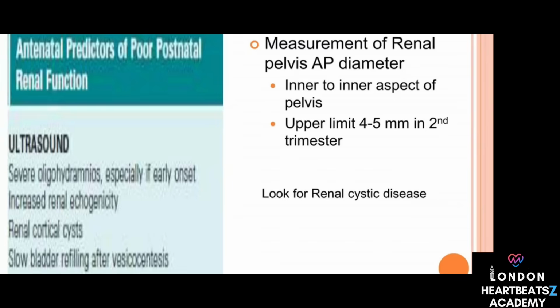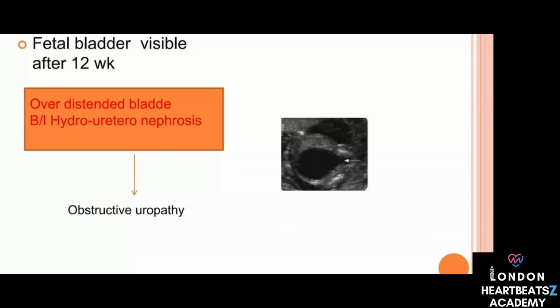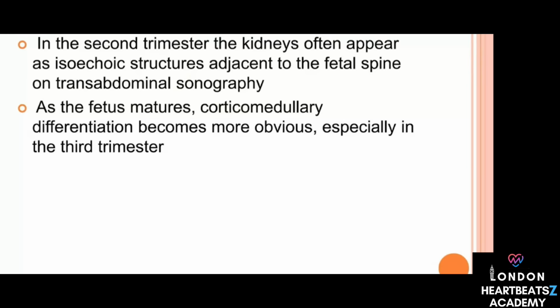to the surrounding tissue located on either side of the fetal spine when viewed from the back in a transverse view. As the fetus matures, particularly into the third trimester, the corticomedullary differentiation, that's the visual distinction between the outer cortex and the inner medulla of the kidney, becomes more obvious. The source includes an image example from a transverse scan at 19 weeks, clearly showing the kidneys as these paired isoechoic structures flanking the spine with just a small amount of fluid visible within the renal pelvis, which is a normal finding. Are the kidney sizes measured similar to how other organs like the femur are measured?